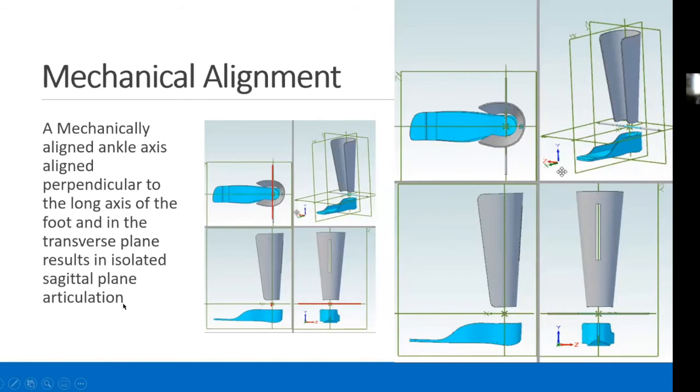That said, if there's an extreme amount of tibial torsion, if you align the transmalleolar axis, I've seen 30, 50, 60 degrees of external rotation, I think, at least in my experience, you have to be partially accommodative of that orientation. If you aren't, then it's very difficult to adjust the orthosis so it's tolerable, because it's really fighting as dorsiflexion occurs. It will really fight the motion of the talotibial joint. So I think that there has to be some compromise there.